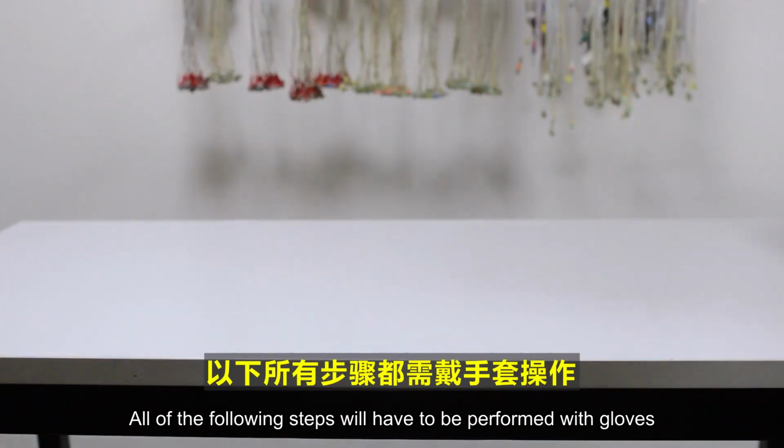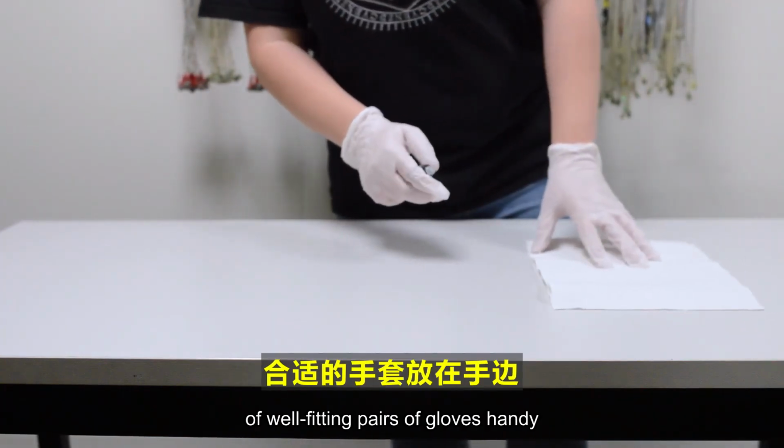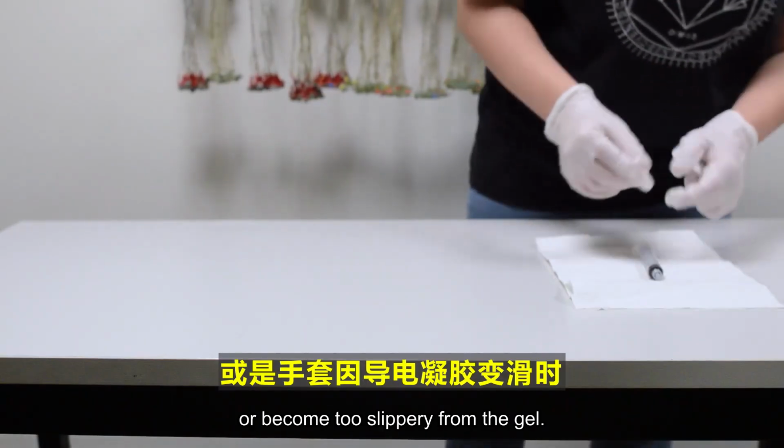All of the following steps will have to be performed with gloves, so make sure that you have at least a couple of well-fitting pairs of gloves handy to change in case they rip or become too slippery from the gel.